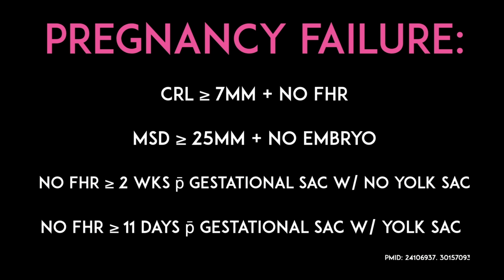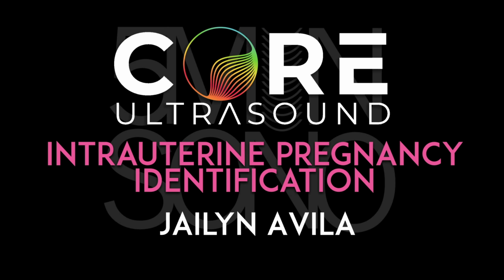This is how you apply those measurements we just talked about for the identification of a viable intrauterine pregnancy.